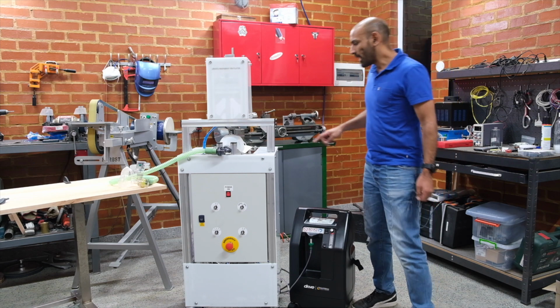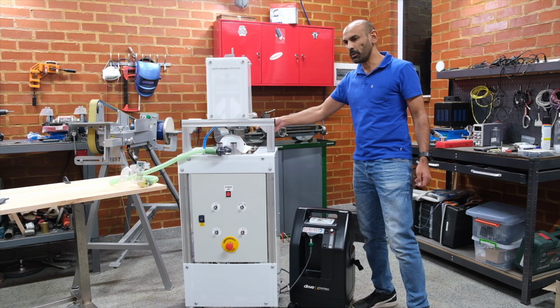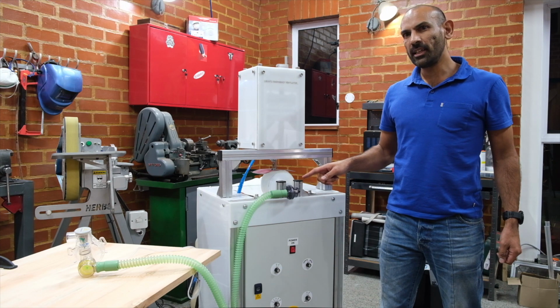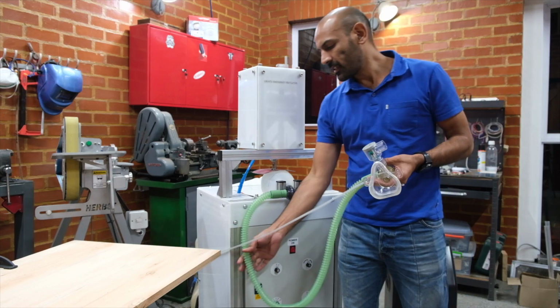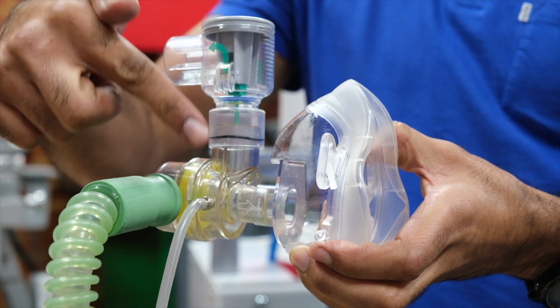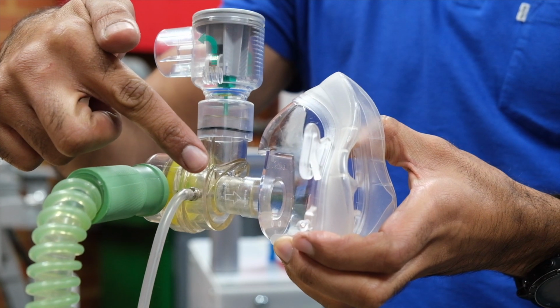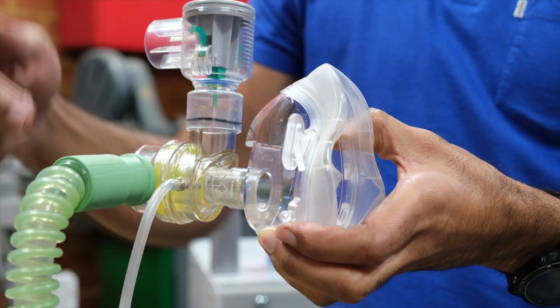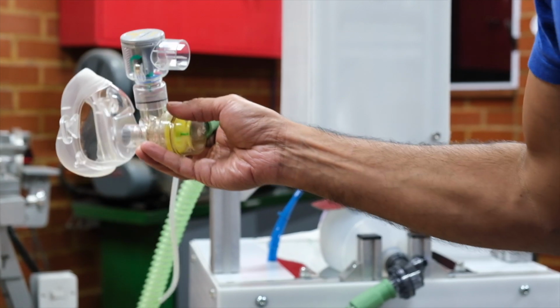If you look around the back of the machine, you'll see how the air connection from the valve connects to the Ambu bag. The machine uses a standard Ambu bag, or BVM, fitted with a safety relief valve. It's then connected to the CPAP mask using a normal corrugated airway. The CPAP mask is fitted with a PEEP valve, and it's also connected on the exhalation side to this airline. And this airline is then connected to the pressure sensor, which provides the trigger for the assisted ventilation mode.